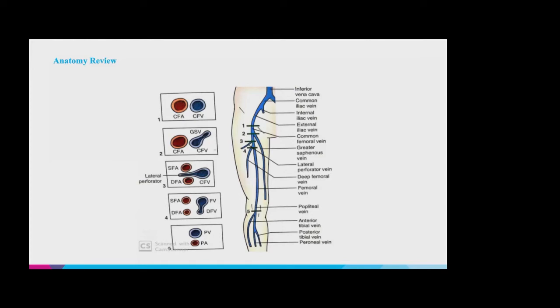You're going to be using your vascular probe because for the most part, these arteries and veins are superficial structures. And so the vascular probe has the best image resolution at these depths. And then for the entire DVT study, the marker should be at 9 o'clock. So it should be to the left of the person getting the images. So hold the marker at 9 o'clock.